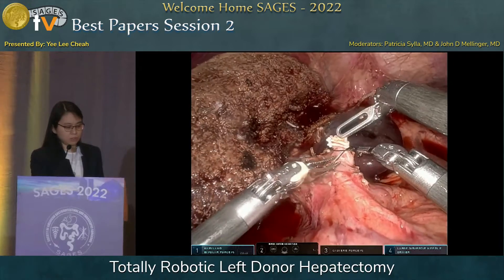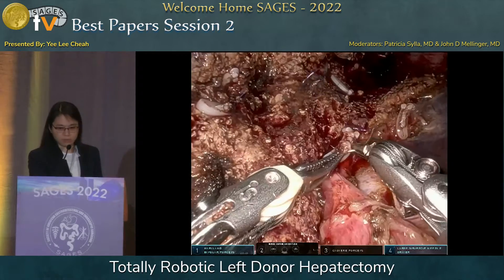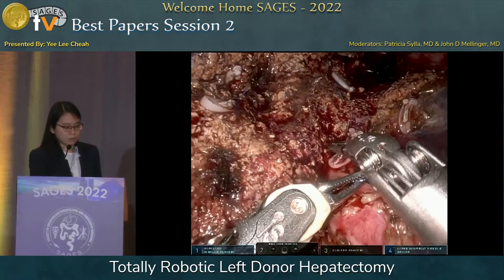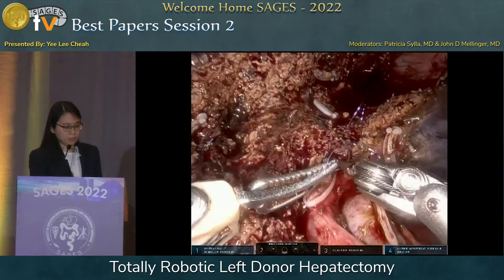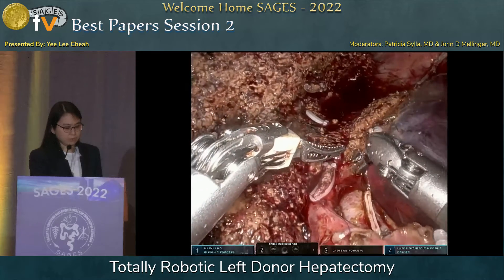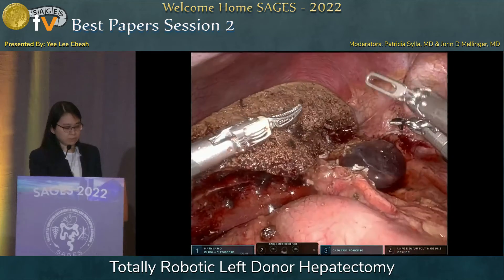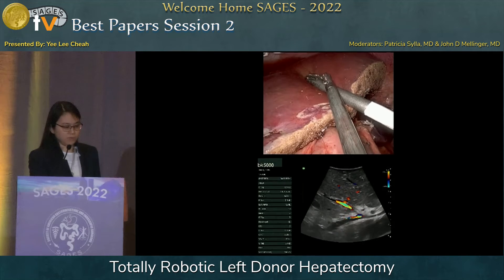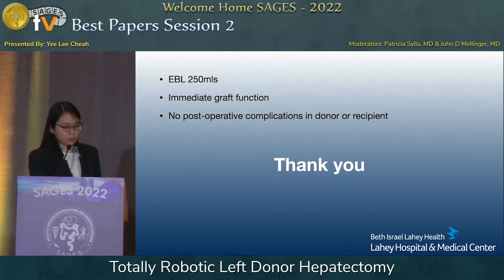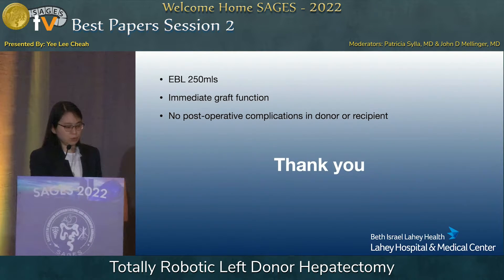The graft is gently inserted into a plastic bag and retrieved via a Pfannenstiel incision. As completion, the artery is ligated and the bile duct stump is suture ligated. There is no bleeding or bile leak. A final check of the remnant confirms adequate vasculature. EBL was 250 mLs. There was no post-operative complication in the donor or recipient. There was immediate graft function.